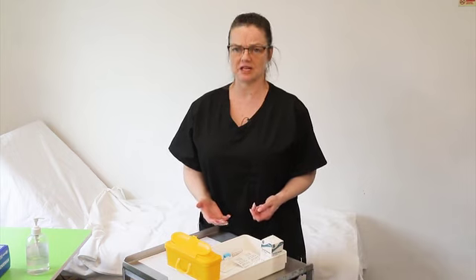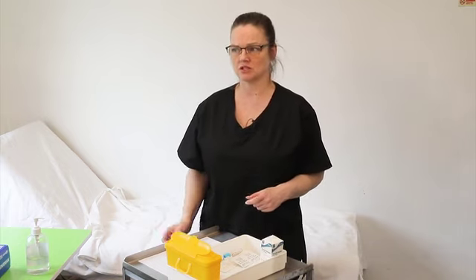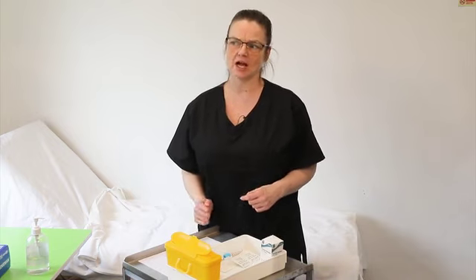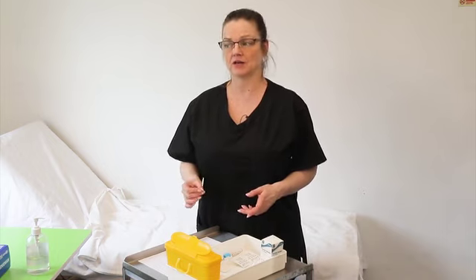So if you can see, obviously, when we're doing insulin, which is one of the main drugs that we inject as nurses, we see a lot of areas that have already been injected in adults. In children, sometimes they have a very small cannula under the skin, and we use that to inject so we don't have to keep pricking the child. But if they are an adult and we are going to administer insulin, we should really look for an alternate site for injection.